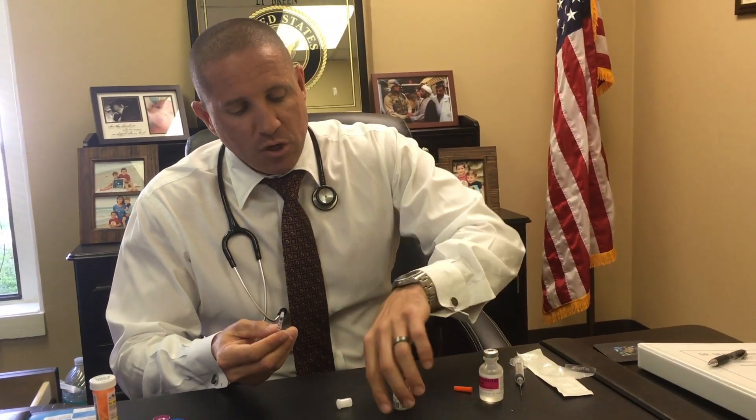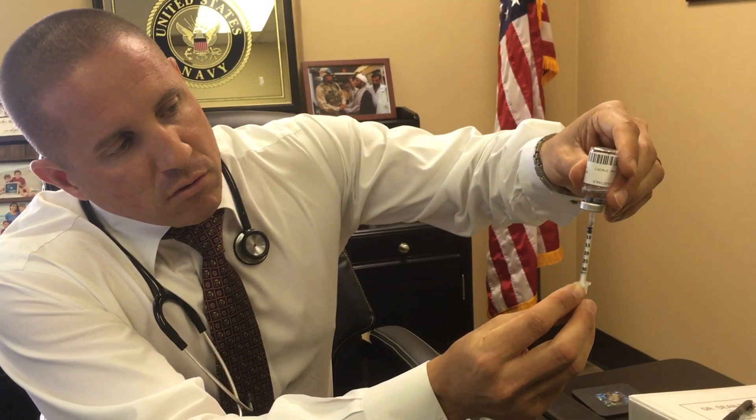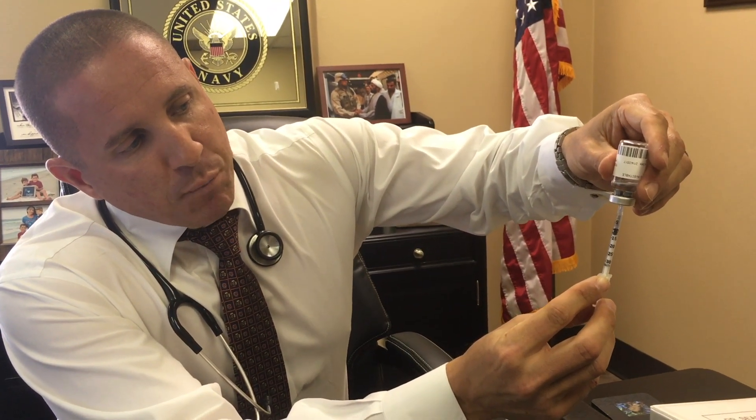When you inject the HCG, use a little insulin syringe that goes from 5, 10, 15, 20, all the way up to 30 — it's 0.3ml's. Turn your HCG vial upside down, take your 0.3ml insulin syringe, stick it right in the center, and pull depending on the dose.